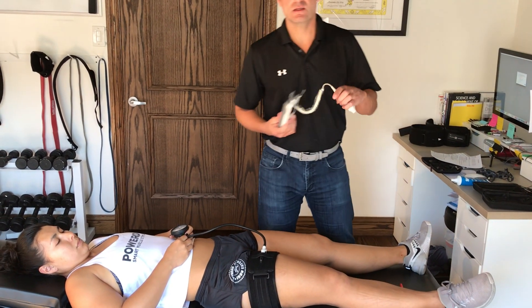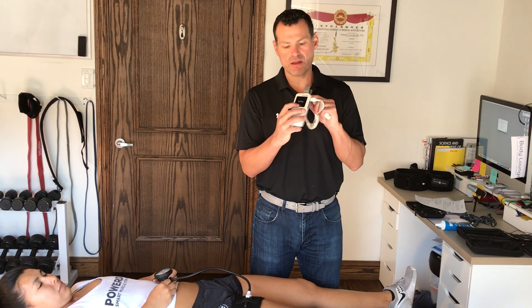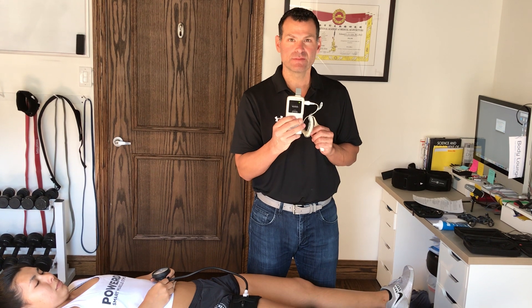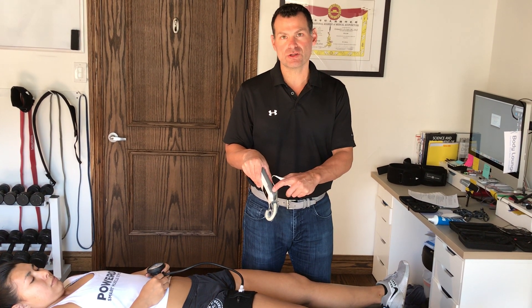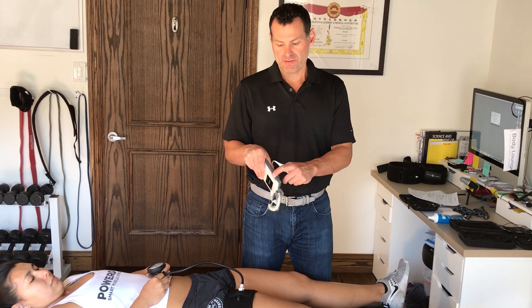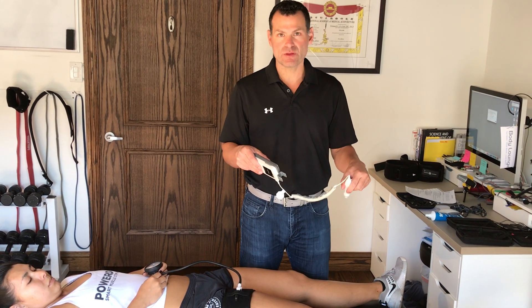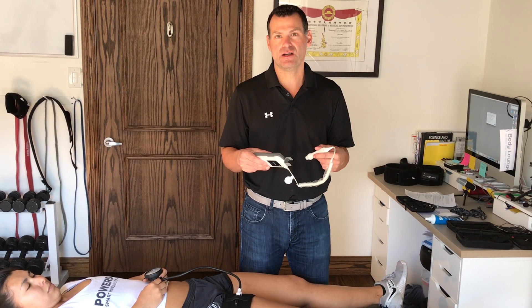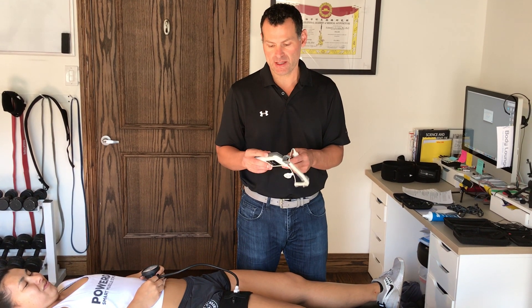Now I'm going to take some ultrasound gel and put it right on that mark. I have my audio-only ultrasound. With these units, all I need to do is press it on until the green light pops on, then double-check that the audio is turned all the way up. If you have it all the way down and don't hear anything while trying to check for the pulse, you'll think you can't find the pulse — but the audio is just down. I've done that before, so don't do that. Turn it all the way up.